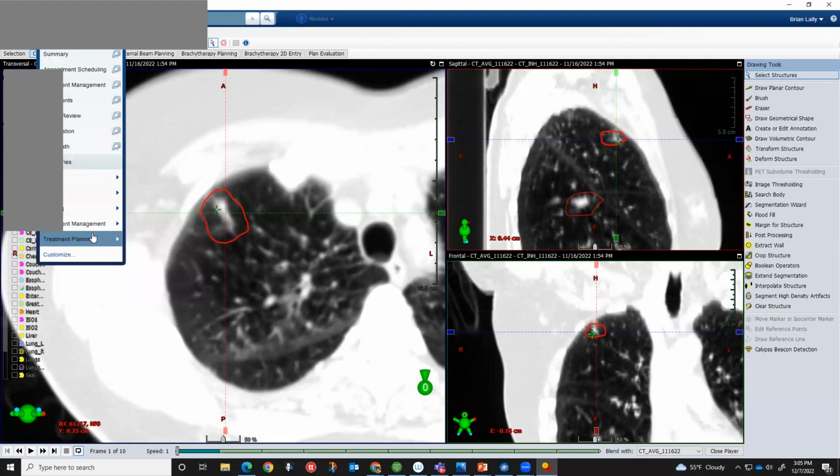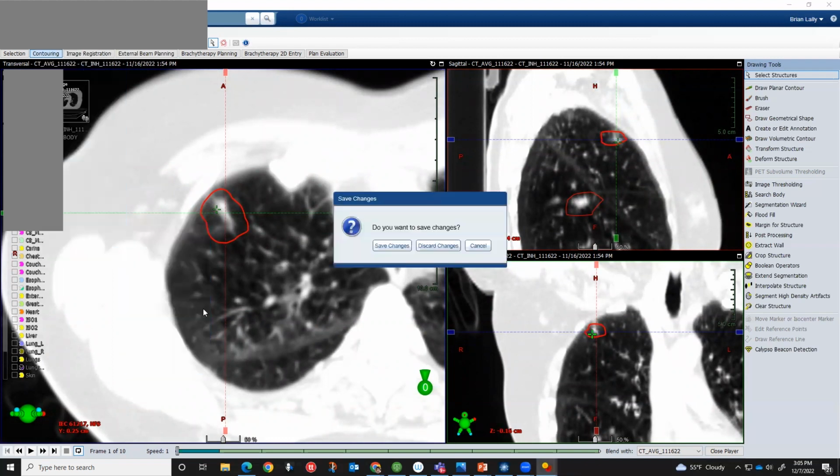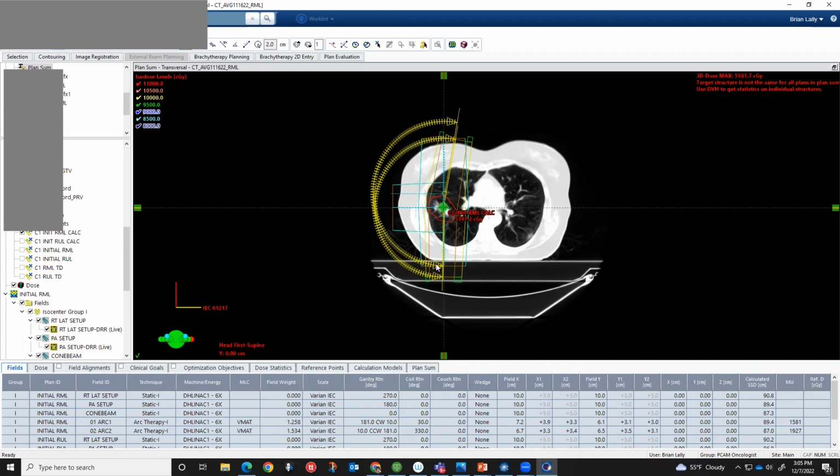Next, we're going to go into our planning software. What you see here is when we treat these patients, we're usually trying to use 2 hemiarcs on the side that the lesion is located. If this tumor was on the opposite side, we'd have 2 hemiarcs over here. But I'm going to take them off for right now.